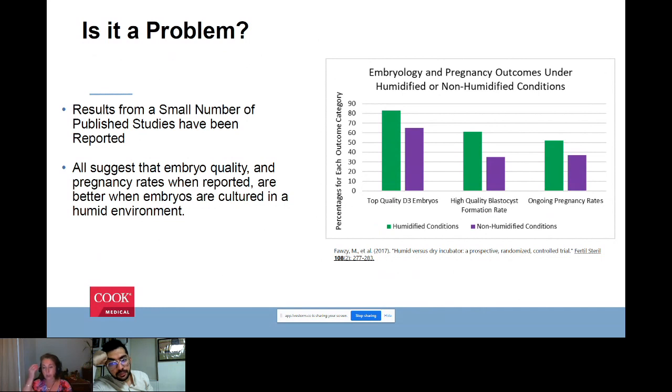But with the humidification, it really depends on the amount of humidified air that is pumped back into the incubator. Also, the reason why we moved to benchtop was to avoid having all of those water pans getting contaminated at the bottom of the incubator. So if you talk only about humidity, the box sounds better because it's really humidified. But if you have continuous humidified gas going through a benchtop incubator, that is actually better because you have a smaller environment to humidify. So you know that small space is completely humidified. Okay.